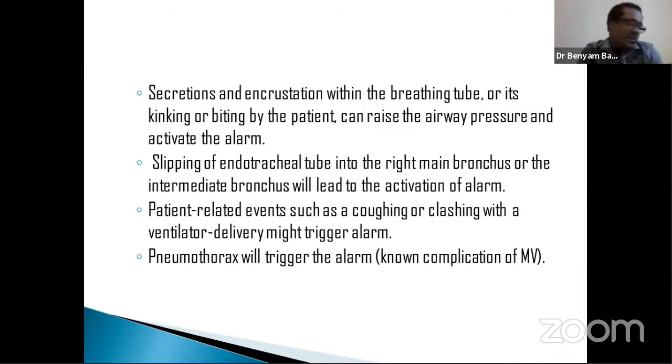The other cause is patient-related. If a patient is coughing, or awake and fighting or agitated, that might trigger the alarm. And the other feared complication causing a high pressure alarm is pneumothorax, be it iatrogenic or from any cause, because there will be high pressure in the chest.